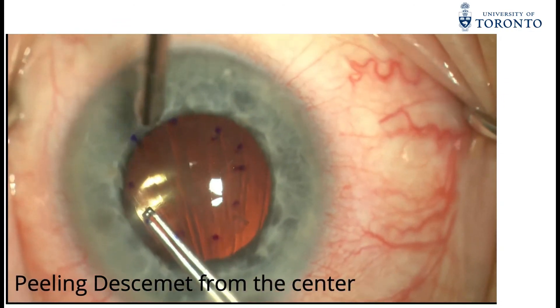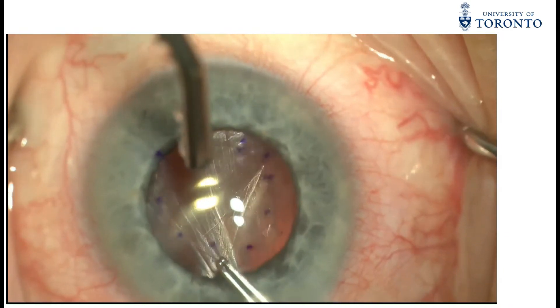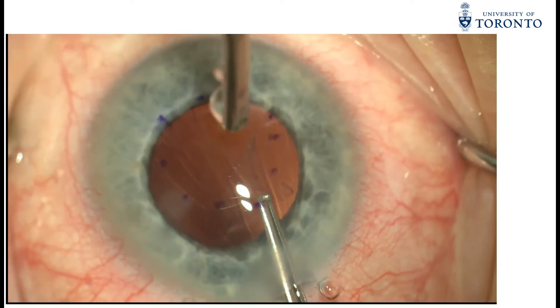This is followed by the Gorovoi forceps being used to perform a continuous curvilinear descemetorhexis in keeping with the 8-point marker.